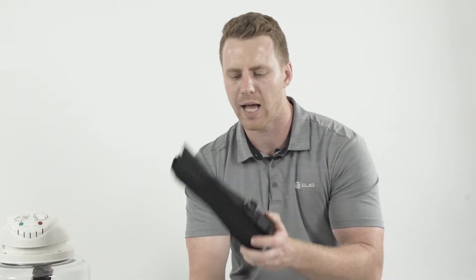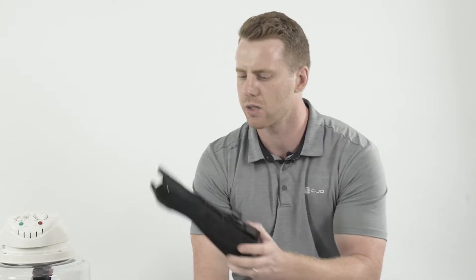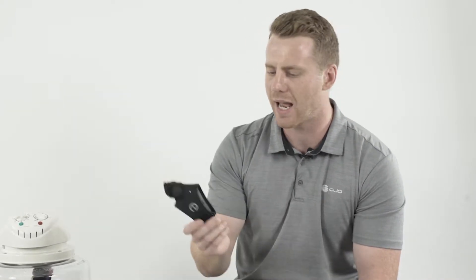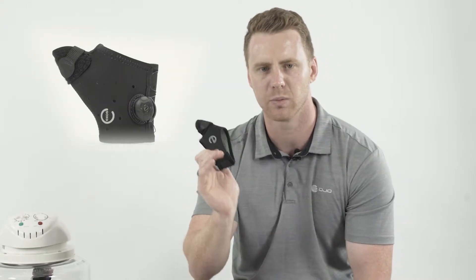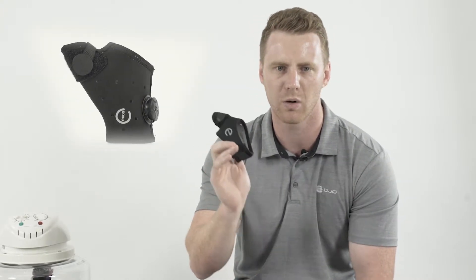We've got arm-based splints like the short arm fracture brace, boxer fracture casts, and long thumb spicas as examples. With the hand-based splints we've got short thumb spicas as well as metacarpal splints, for example ulnar gutter and radial gutter casts.